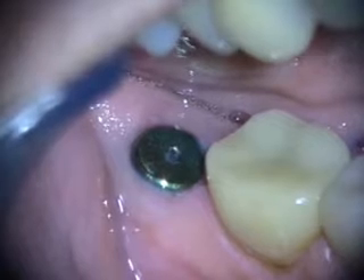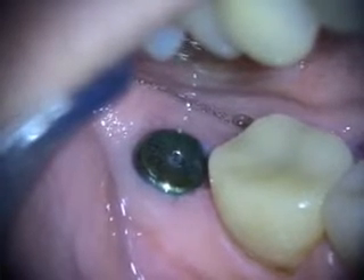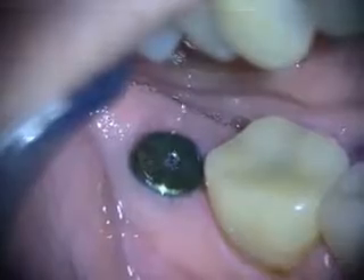This is the six-week healing of the immediate implant in the number 31 area, and we'll take a look at the x-ray next.